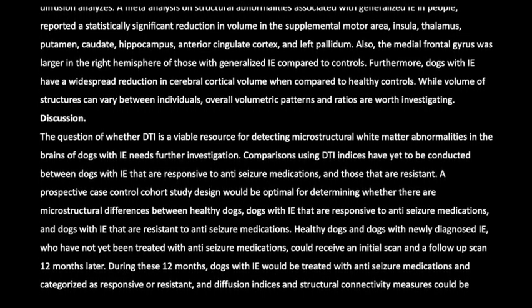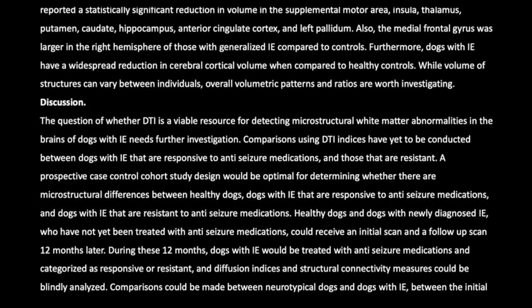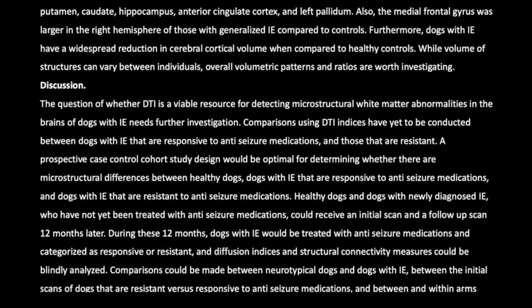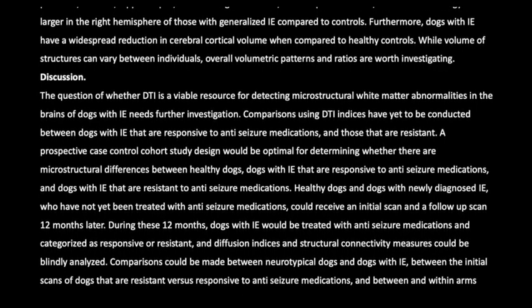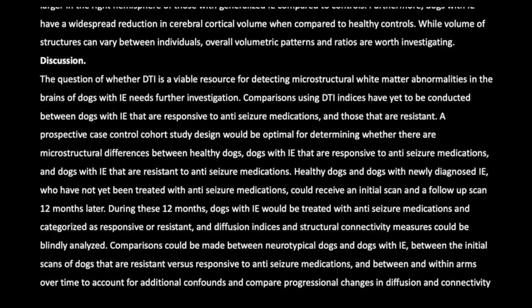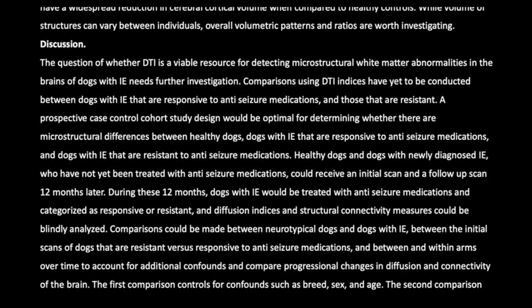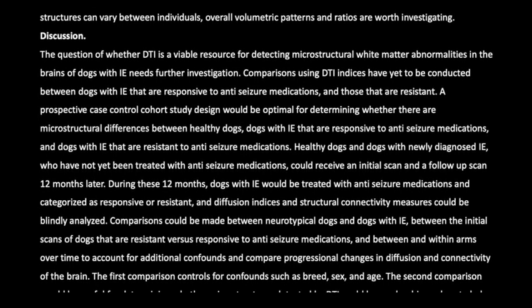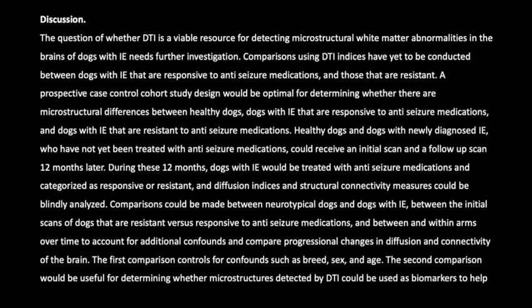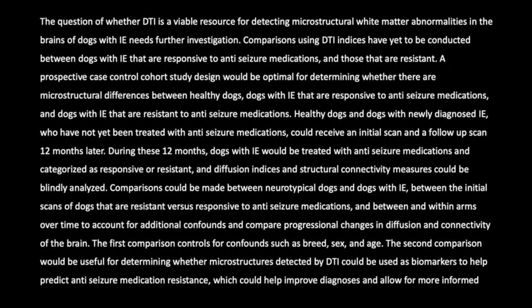Discussion. The question of whether DTI is a viable resource for detecting microstructural white matter abnormalities in the brains of dogs with IE needs further investigation. Comparisons using DTI indices have yet to be conducted between dogs with IE that are responsive to anti-seizure medications and those that are resistant. A prospective case control cohort study design would be optimal for determining whether there are microstructural differences between healthy dogs, dogs with IE that are responsive to anti-seizure medications, and dogs with IE that are resistant to anti-seizure medications.